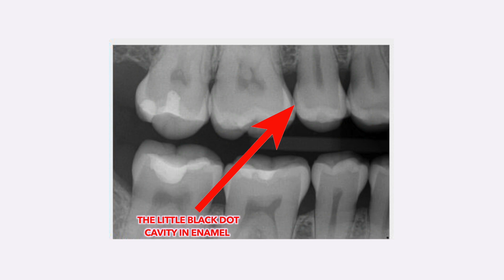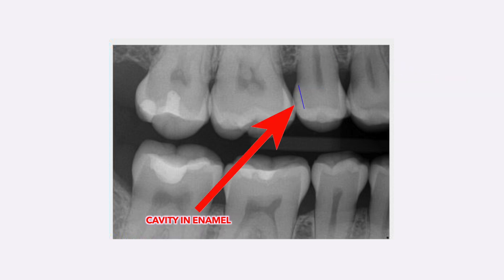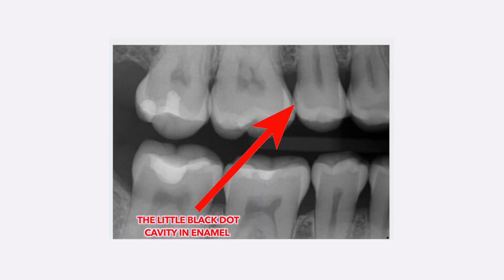If you do look closely, sometimes a cavity can be present only in the enamel of a tooth, which is called incipient decay, and maybe it will never cross the DEJ — which is the junction between the dentin and the enamel. This line right here is what separates the enamel, which covers the crown of the tooth, from the dentin — the part of the tooth beneath the enamel, a more inner layer of the tooth.